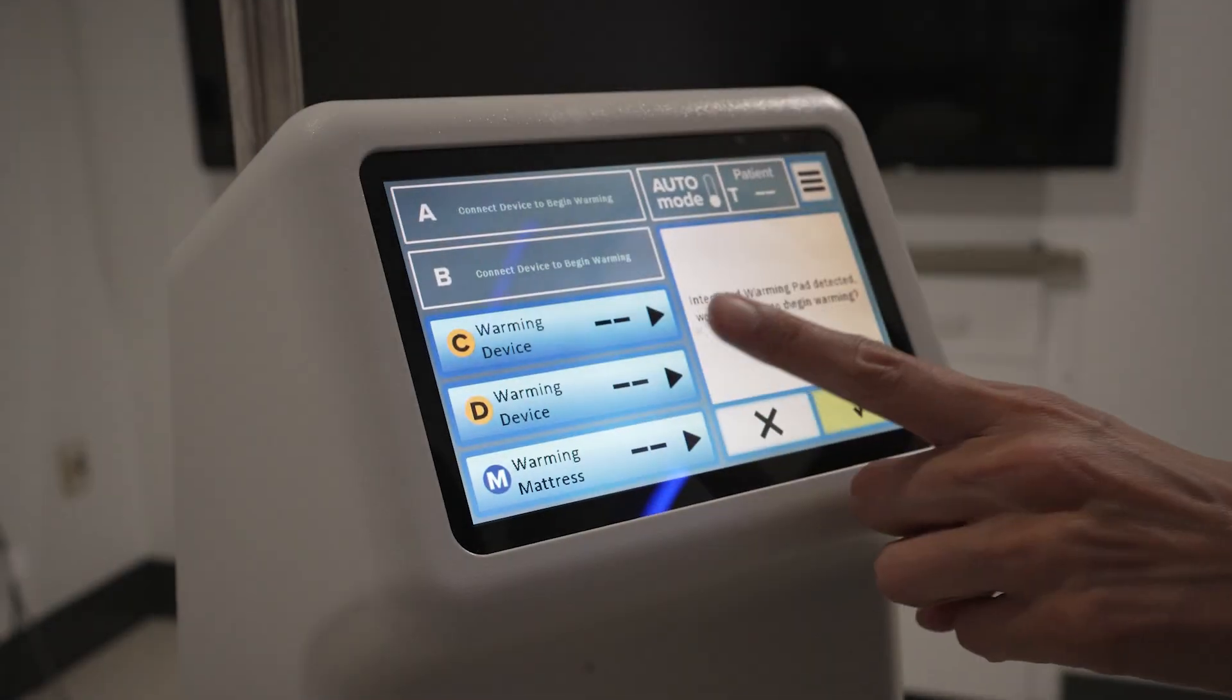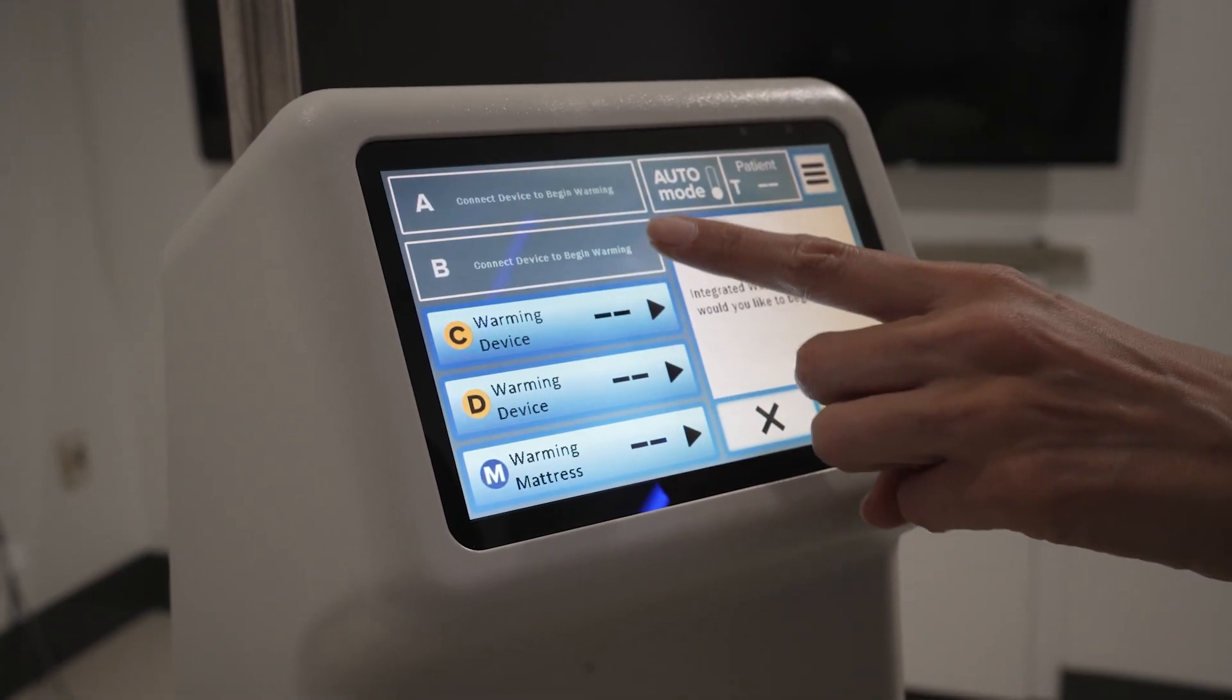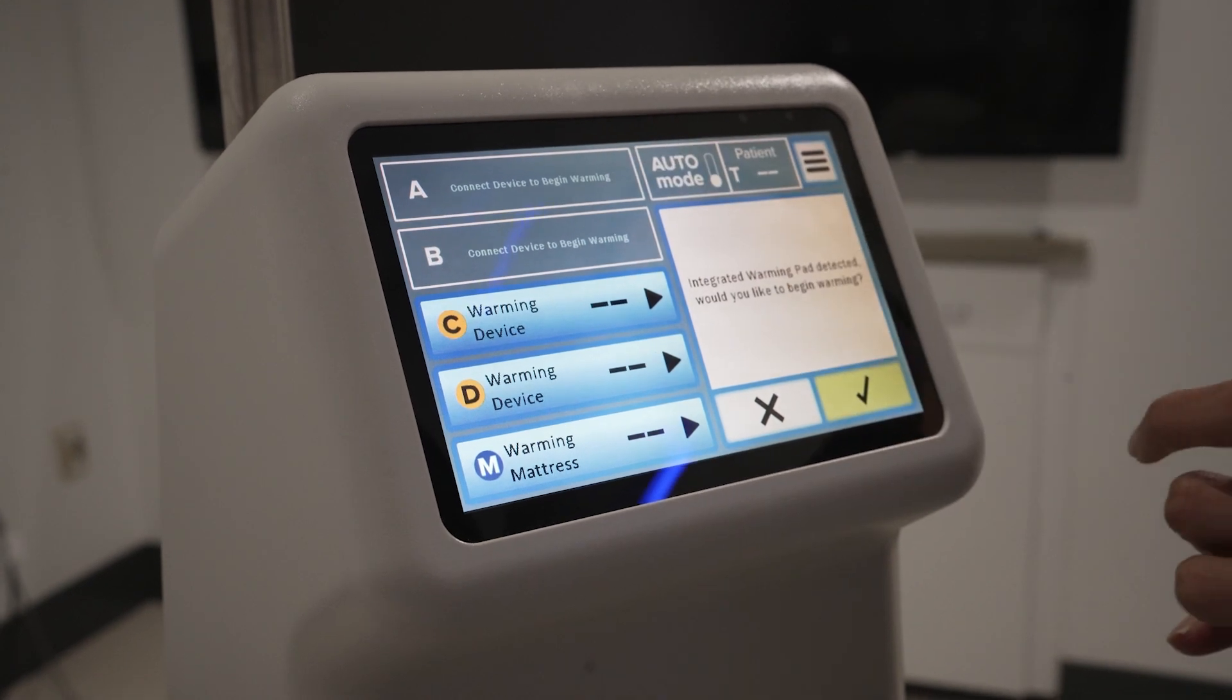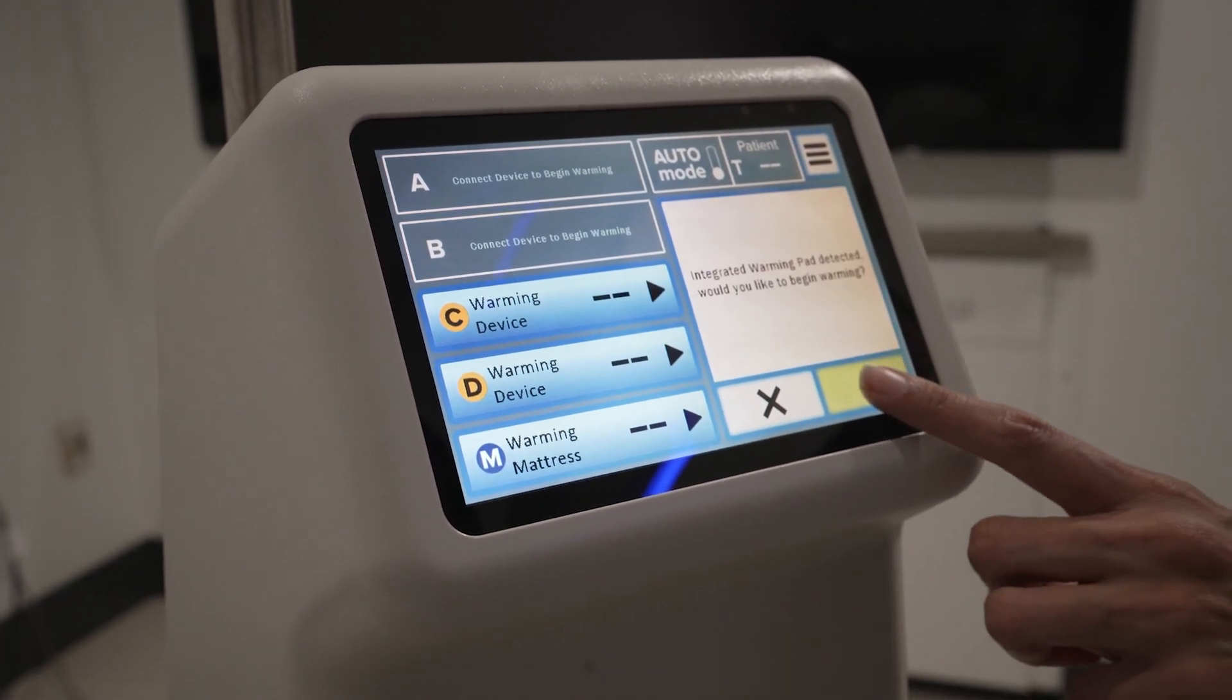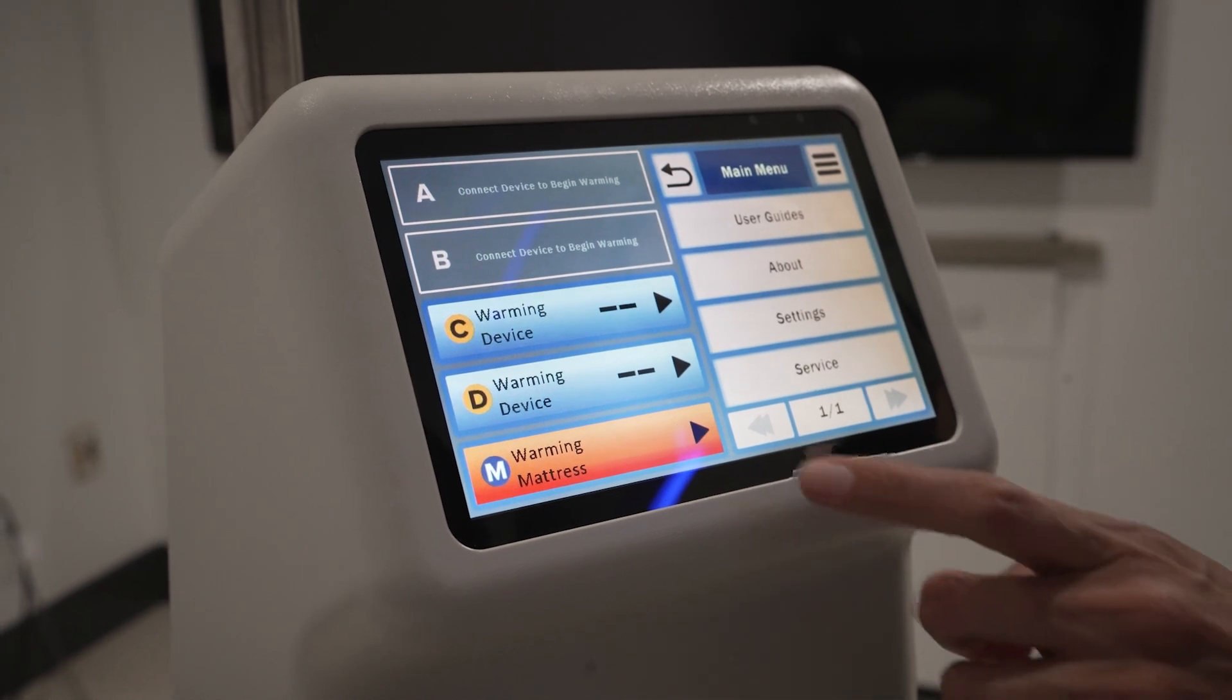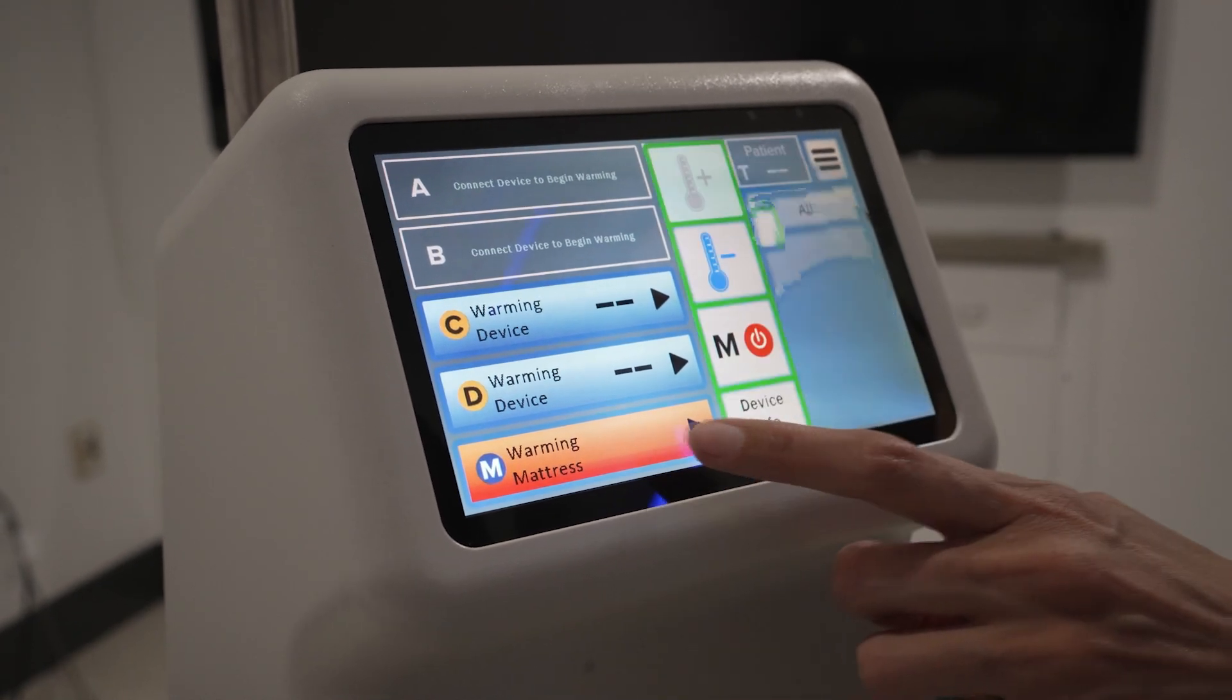The temperature management controller allows you to control the table pad and up to four additional blankets, individually or all at once. These temperatures can be adjusted in 1 degree Celsius increments.